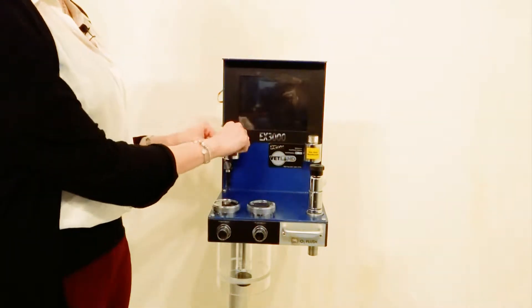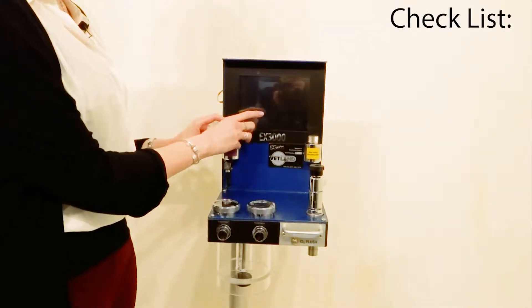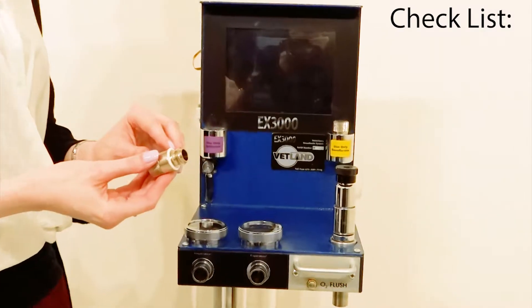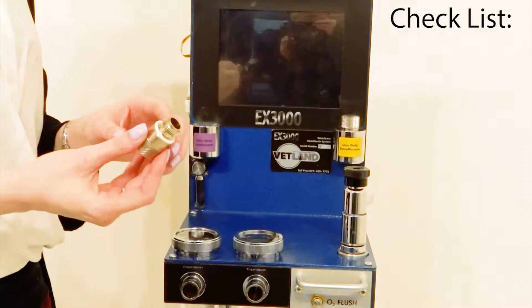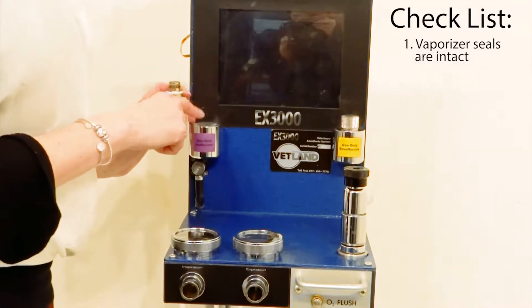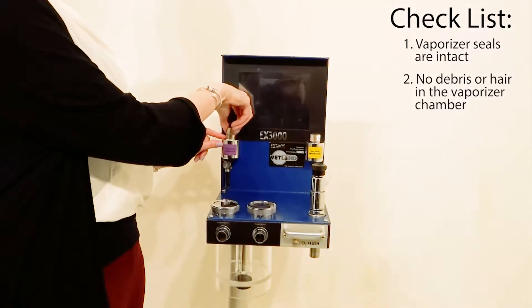The first would be both of the SIVO and ISO caps for the vaporizers. You want to make sure that these seals, either white or black, are all intact and that they don't have any visible cracks. You also want to look in the chamber and make sure there's no debris or hair in there, as that can cause a leak.